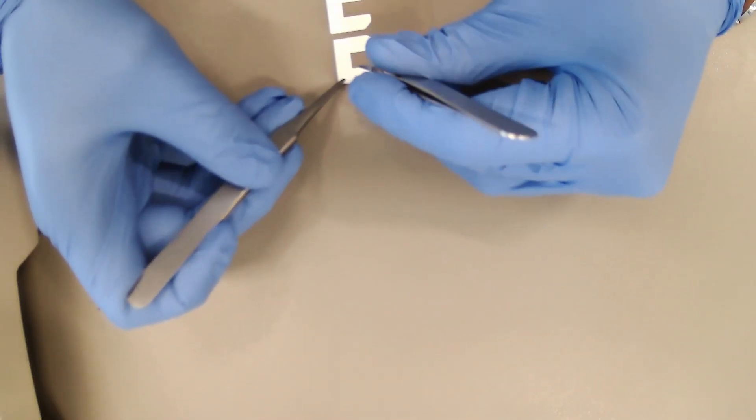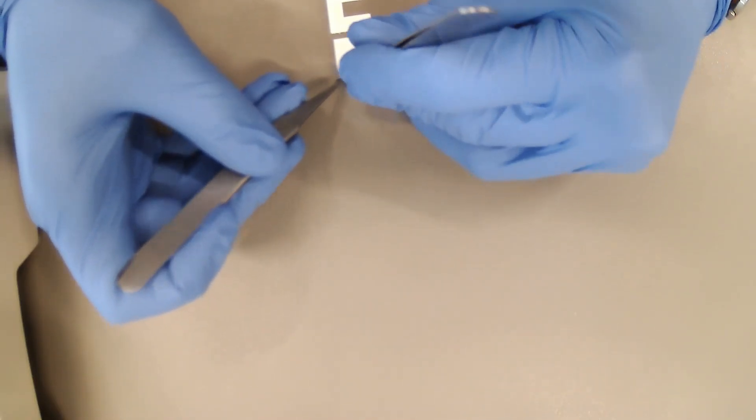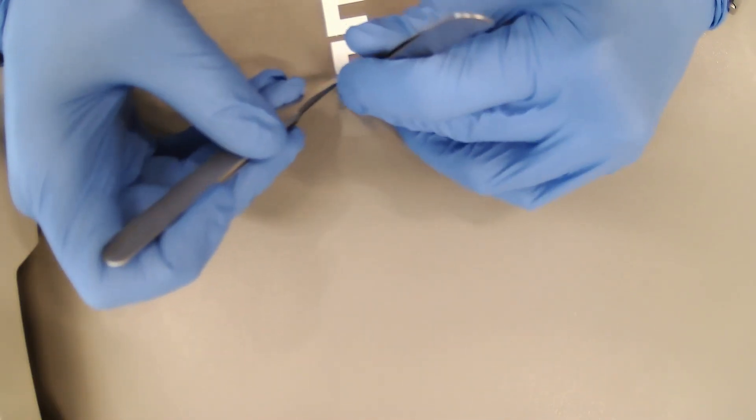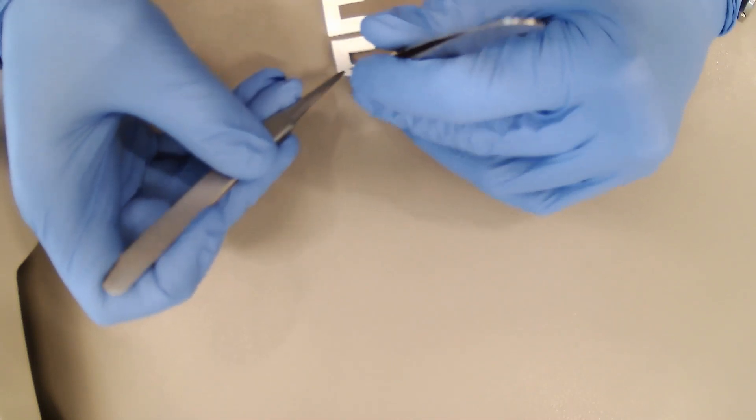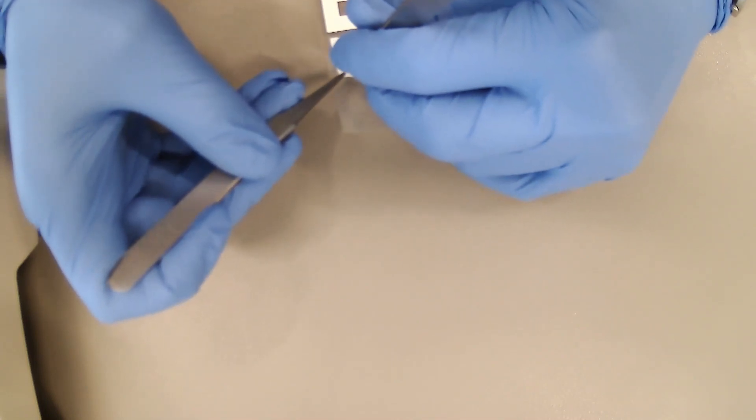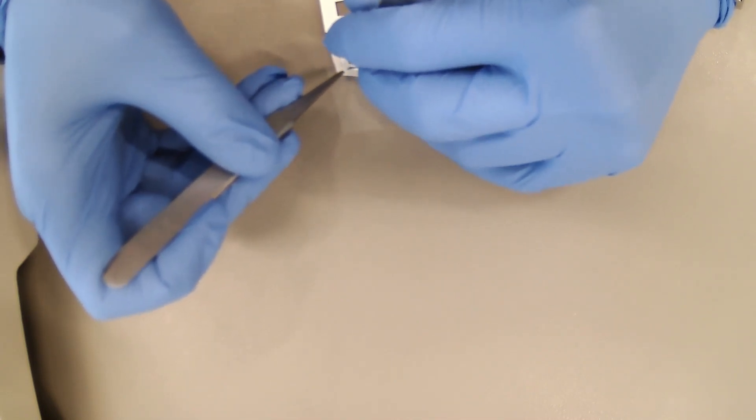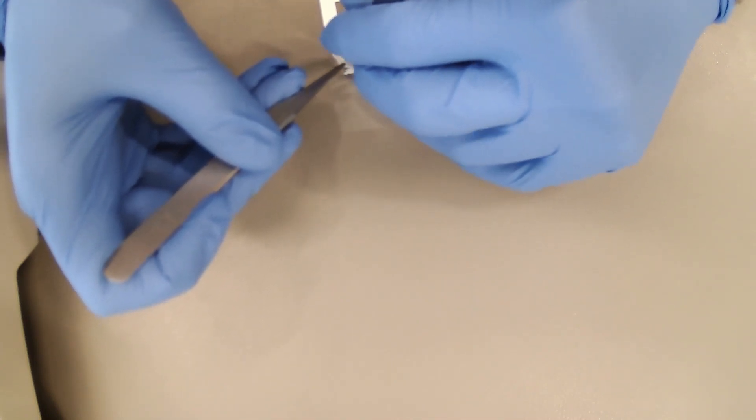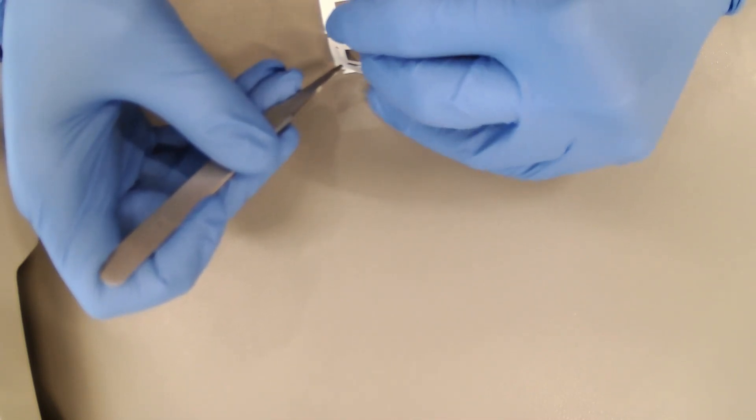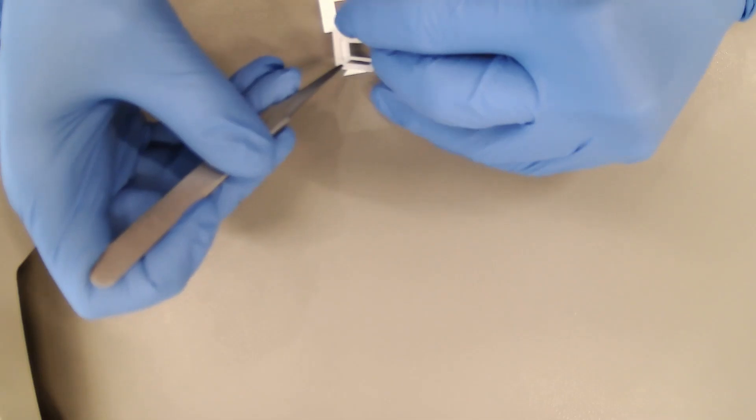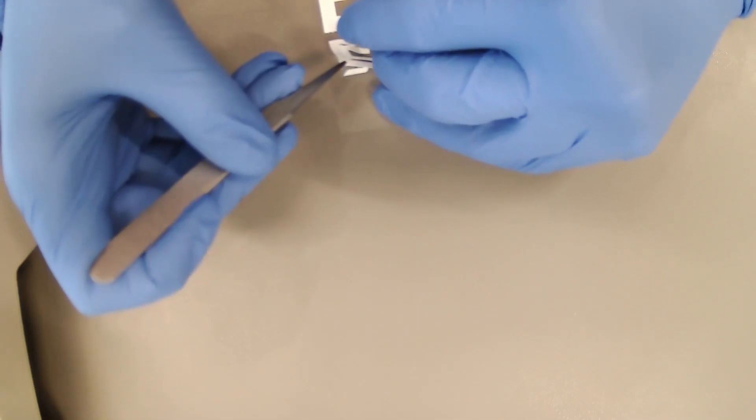The first layer is the sweat collecting reservoir. This layer will fix the patch to the skin. It also ensures the correct SPE orientation and acts as a collecting reservoir for sweat.